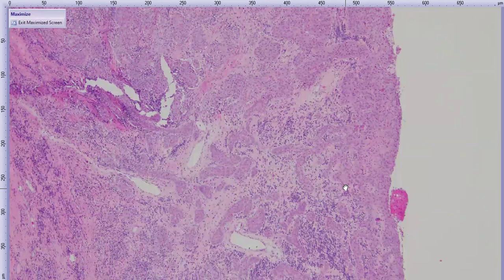And the reason why this is an interesting variant of squamous cell carcinoma in horses in particular is that grossly and histologically, you may have another differential for this cornea. And I can ask the room and be quiet this time, maybe. What might be another differential for a thickened and opaque cornea in a horse? Fungal granuloma? Nice, fungal. Yeah, so mycotic keratitis would be a common differential for this clinical and gross presentation.